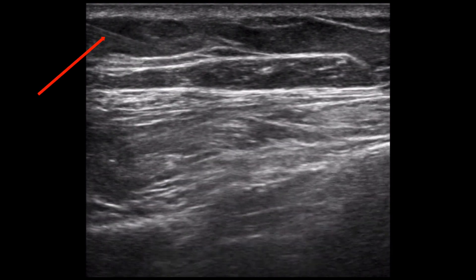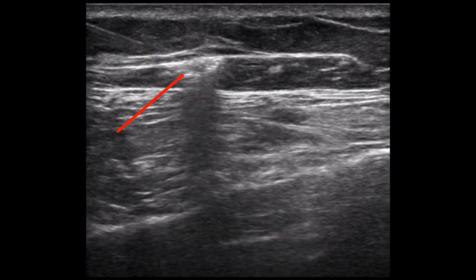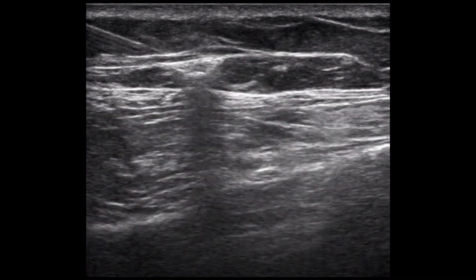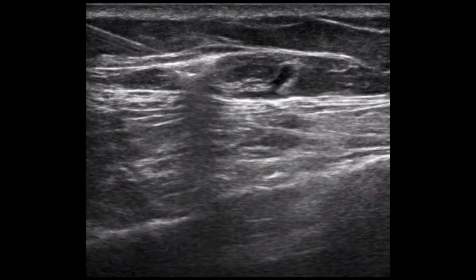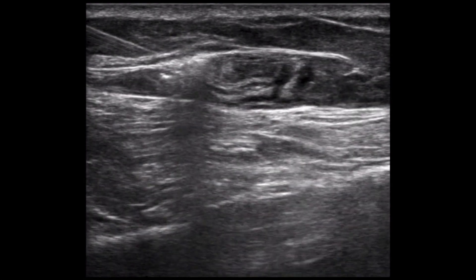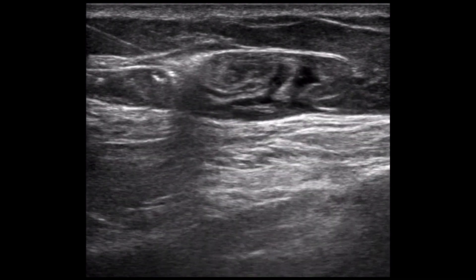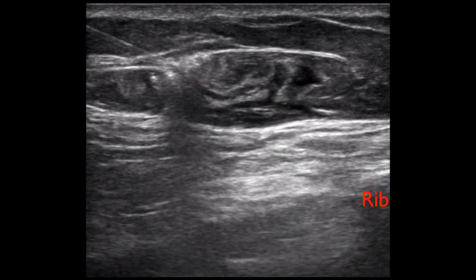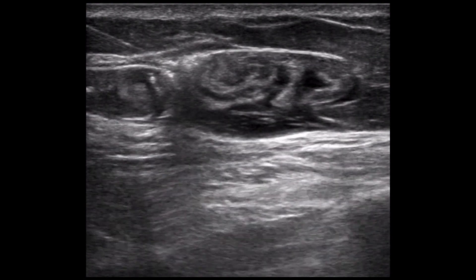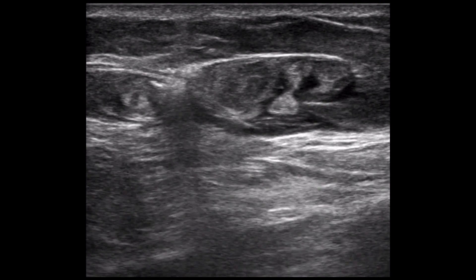We can see the needle enter at the left of the screen. A small bolus of fluid is instilled to help clarify needle tip position. Additionally, this serves the function of a concept known as hydrodissection. The fluid is utilized to dissect the fascial plane, expanding the potential space on top of the serratus muscle in which we instill the anesthetic solution. The trajectory is towards the rib as previously discussed. Unlike last month's ultrasound-guided IV case where I advocated for a short-axis view of the needle, I advocate for a long-axis approach for this block.